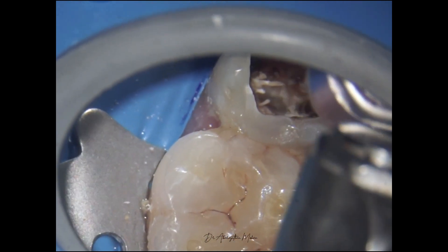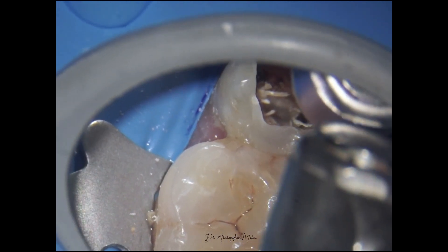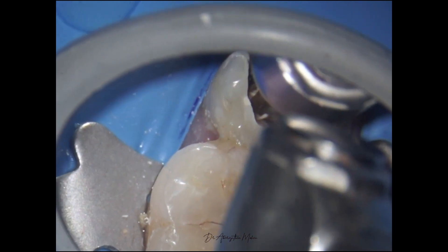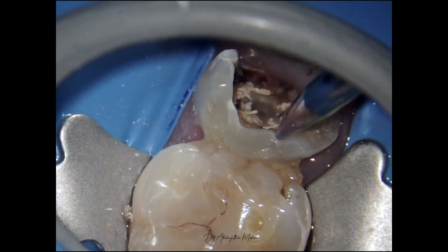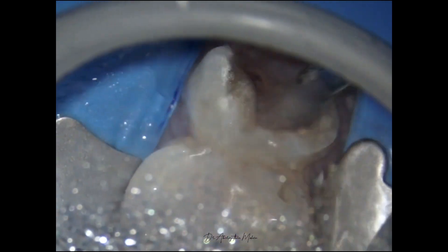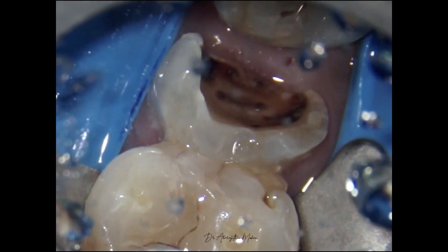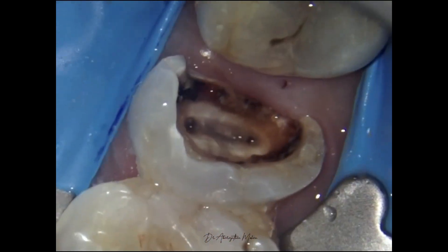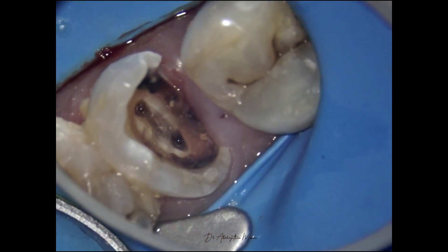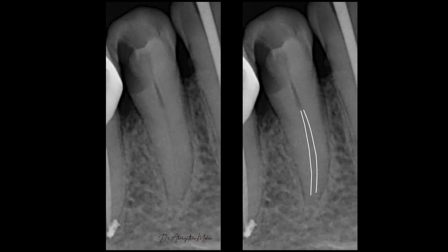Now, it's not that this case cannot be managed without these long neck burs, but we can easily avoid iatrogenic errors like damaging the floor or creating a perforation, because as I already mentioned, we are working with a lot of control. So these burs are not just for de-roofing the roof of the pulp chamber.